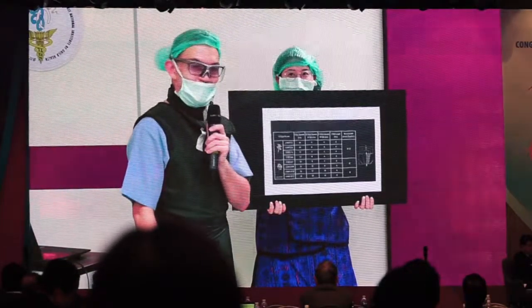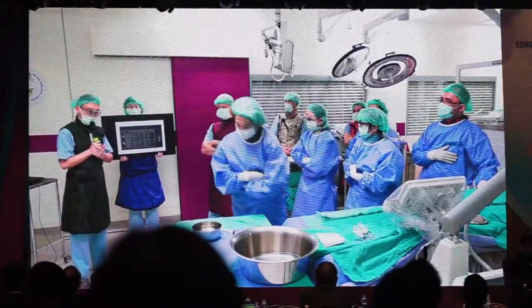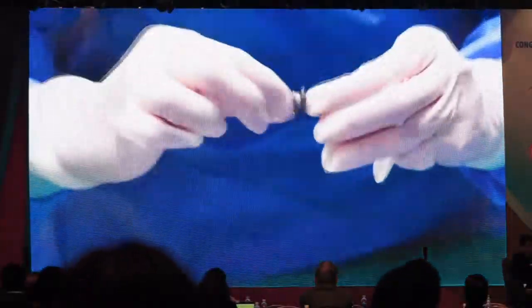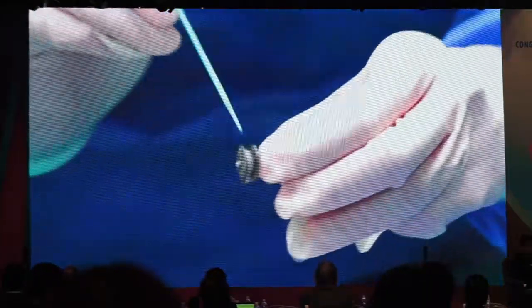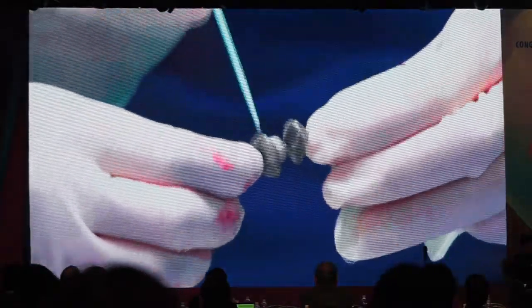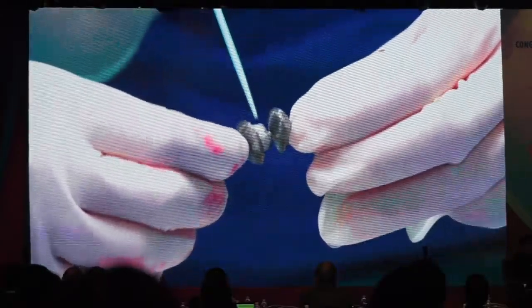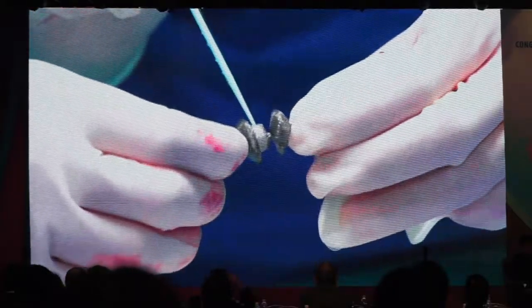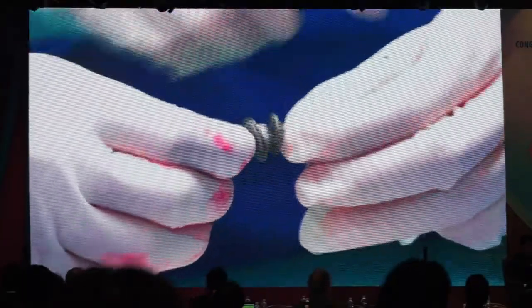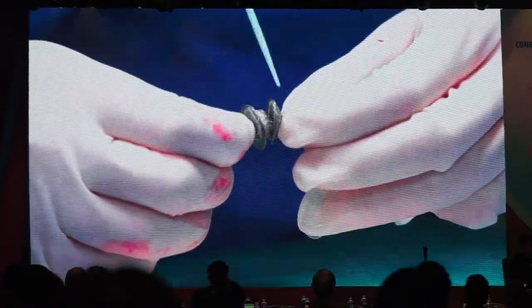When the sheath is across, we reduce the shunt flow, so with the same amount, or even more, of contrast, we can see more of the anatomy and tell more about the size of the defect. We can check with the panel and the audience what size of device to be used. Maybe he's hiding behind, so maybe he can tell us what size he thinks. Are we discussing what type of device we are using, ADO1 or muscular device or other? So what's the panel's view on this? What type of device and how to size it?